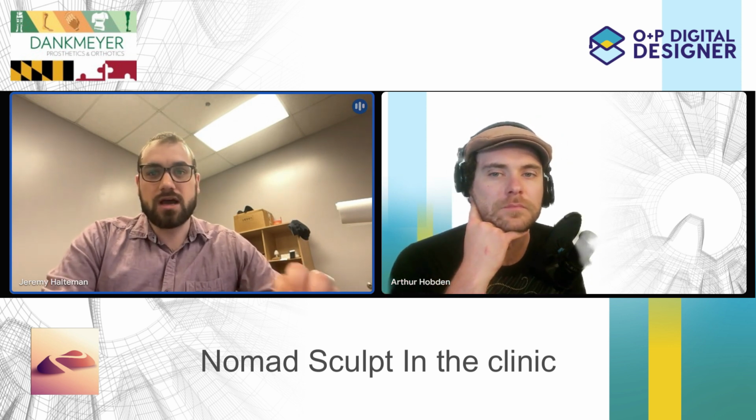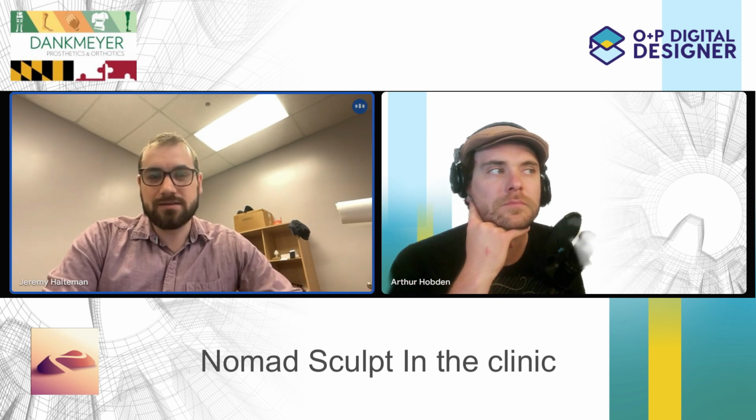A lot of the tools in Nomad are very dependent on the size of the pixel that you're influencing. If you're smoothing a very small pixel, the smoothing is less effective versus if you're smoothing a large pixel. That's true for both voxels and meshes. But when you force it into a voxel, it does a really good job of making them equal size. It works both ways though. It depends what your topology is. If you have a generic shape, voxeling works great. If you have a really tight radius or something that needs to maintain a high corner, mesh is going to be better.